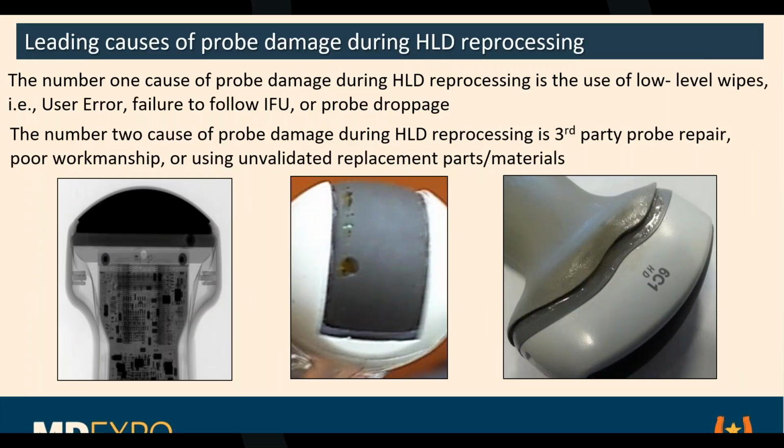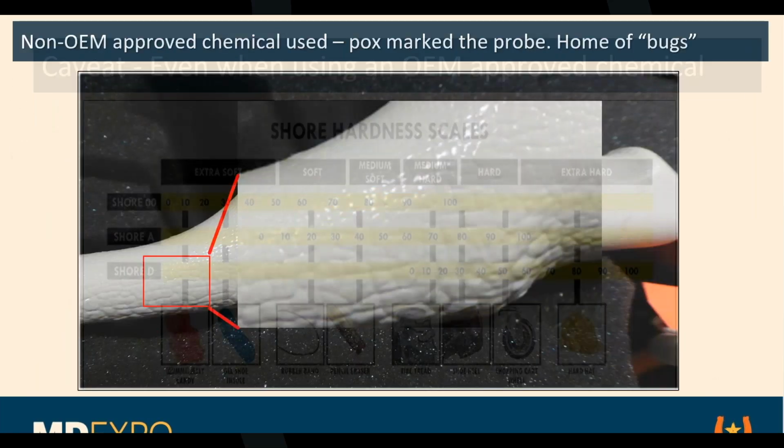They used a different material. The hospital sent it to us, and we ran a spectrometry test on it and discovered that it had a very low Shore A hardness. And this went into a Trophon device, which heats up the chamber that it's being disinfected in to 50 or 60 degrees C, and just melted the lens off of it. It never would have happened with the OEM version, but because they used sub-strength materials, it did happen to it.